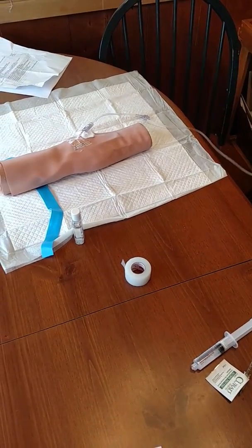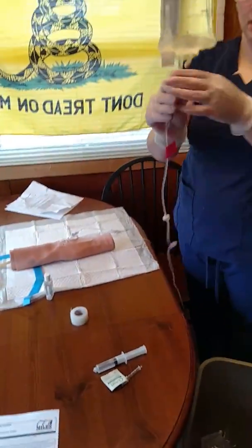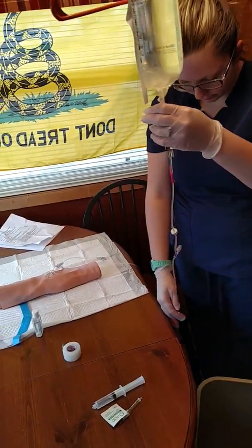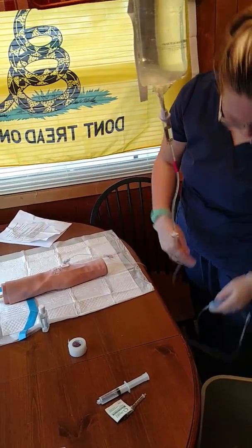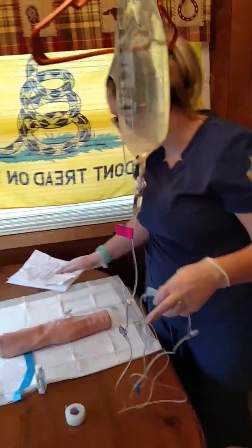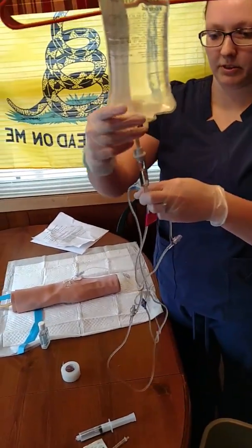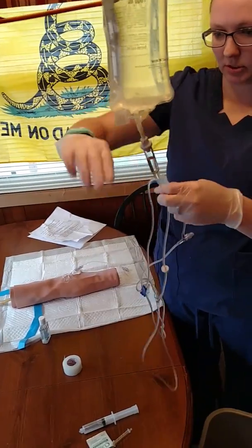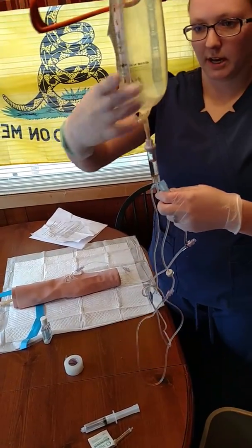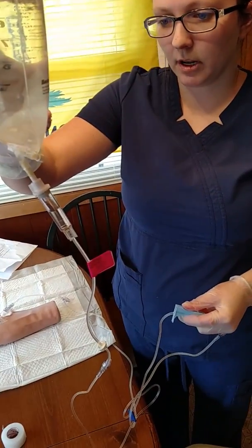And make sure all of our... Alright, let's get going here. So we want 28 drops per minute, so that's about 7 drops in about 15 seconds, just for my timing purposes. Just kind of hold it here, open it up.